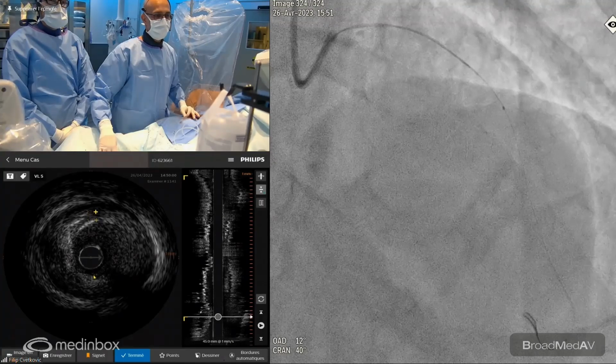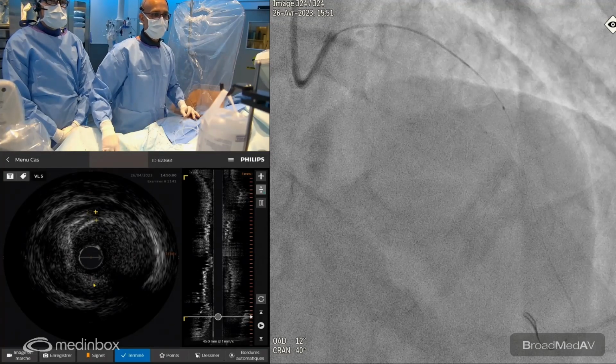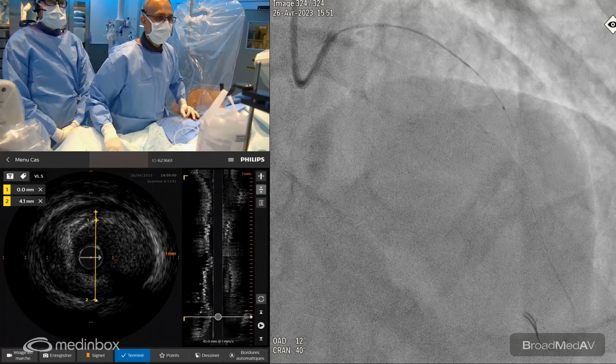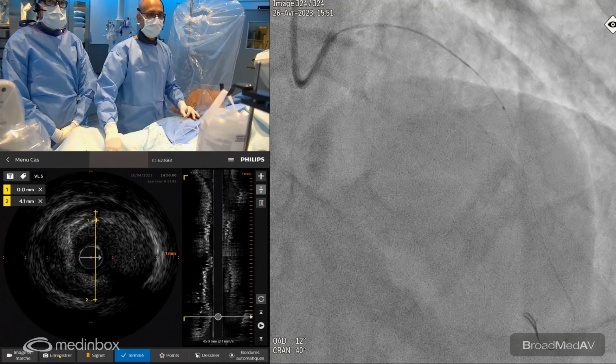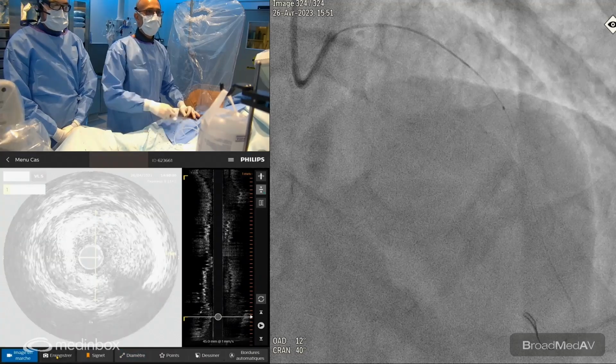Parfait. No, I need you to measure the external elastic lamina. Go beyond, down, wall. Further down. Yeah, I need that measurement. So we have a left main of 4 external elastic lamina. Go further beyond. So we'll perform orbital atherectomy of the LAD.